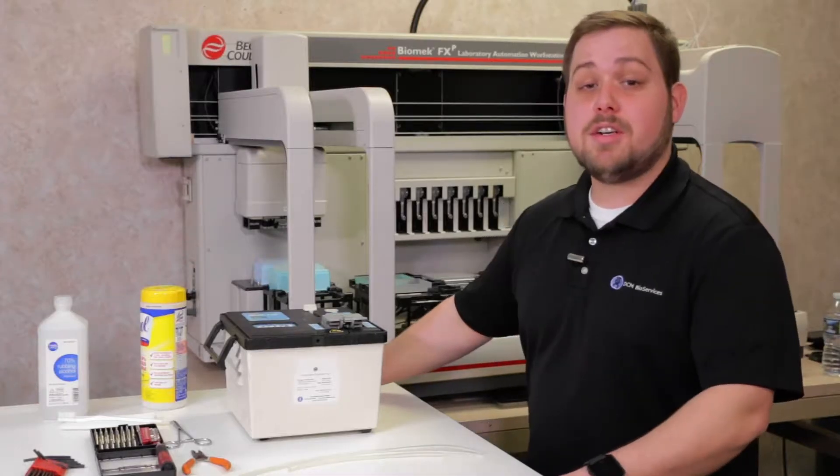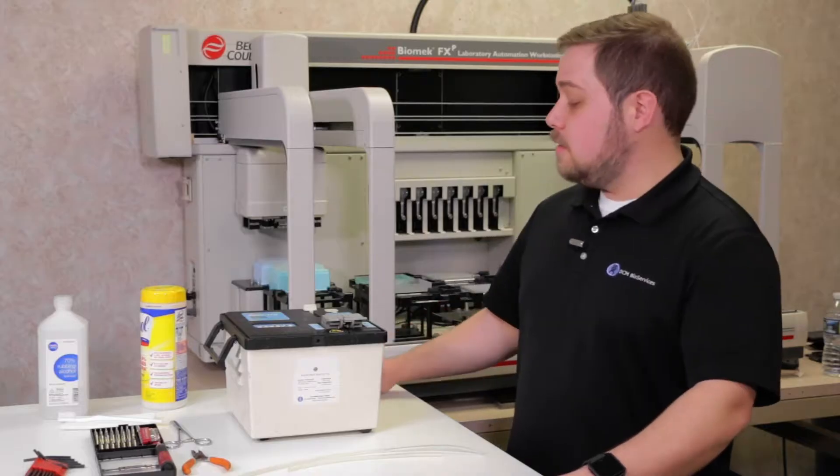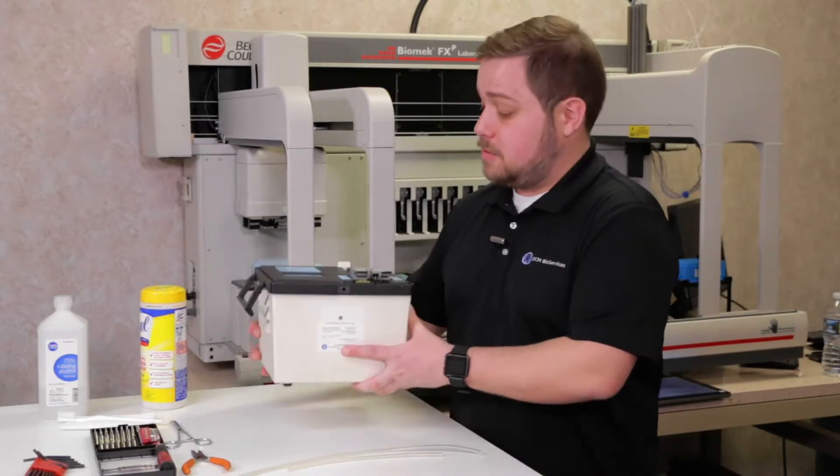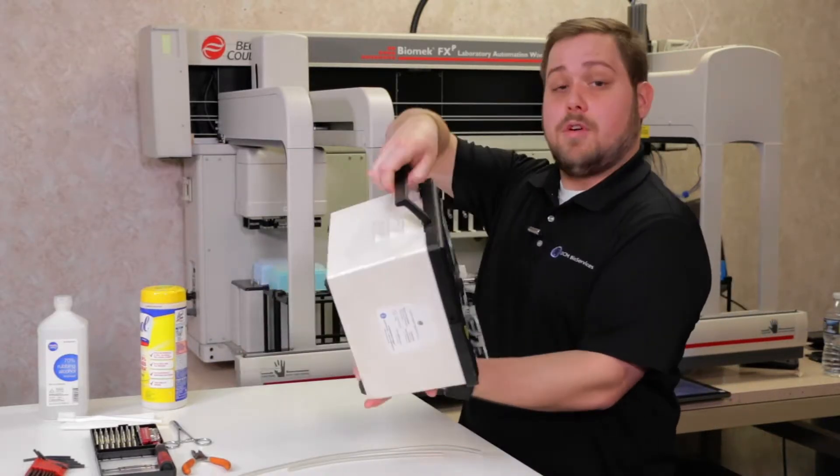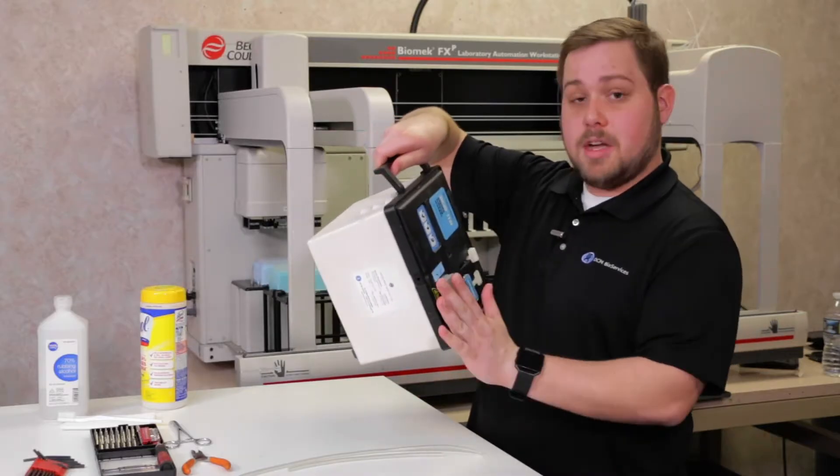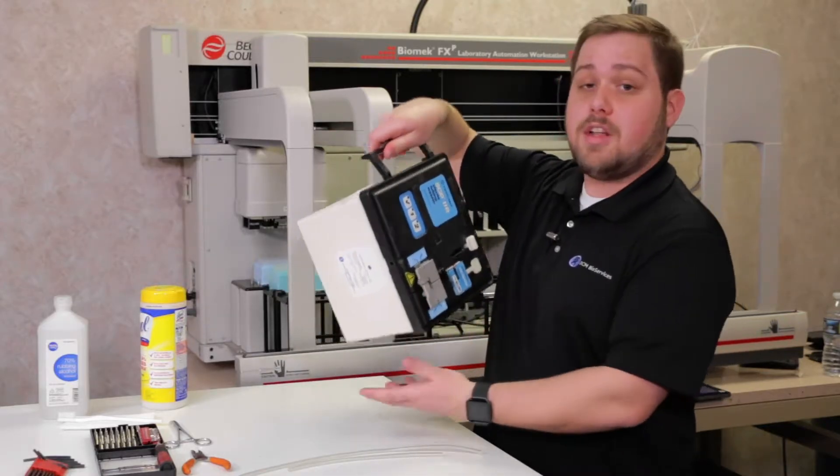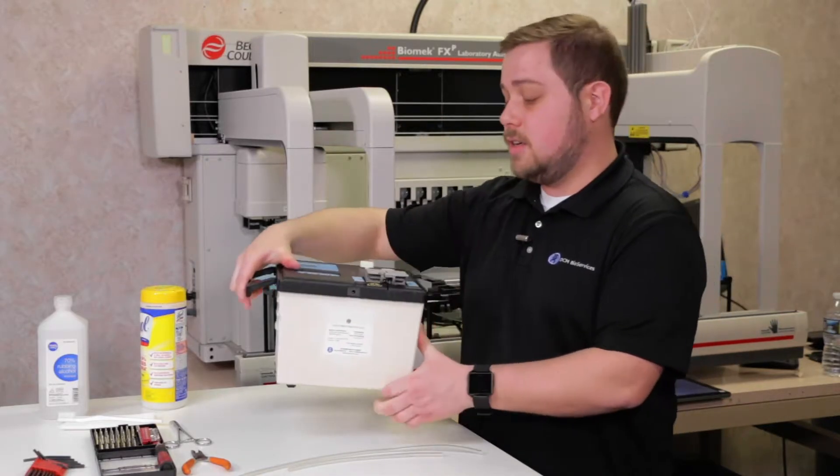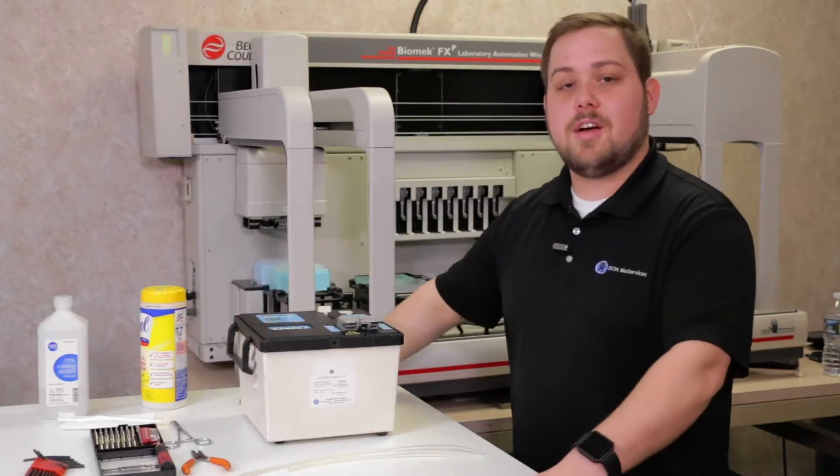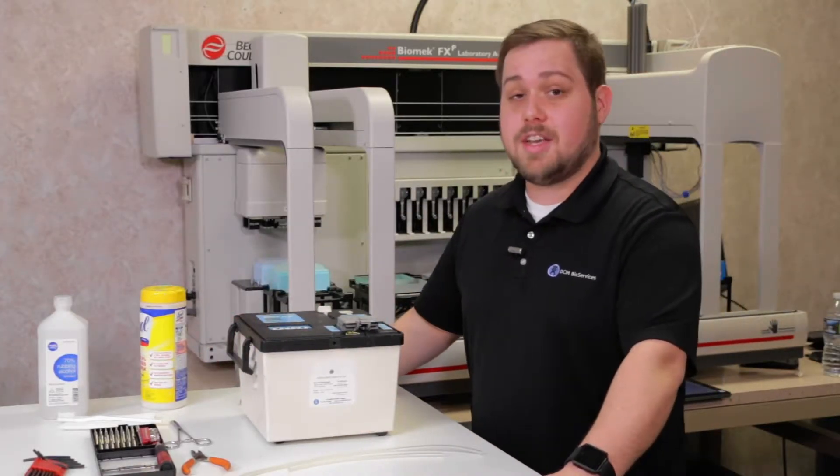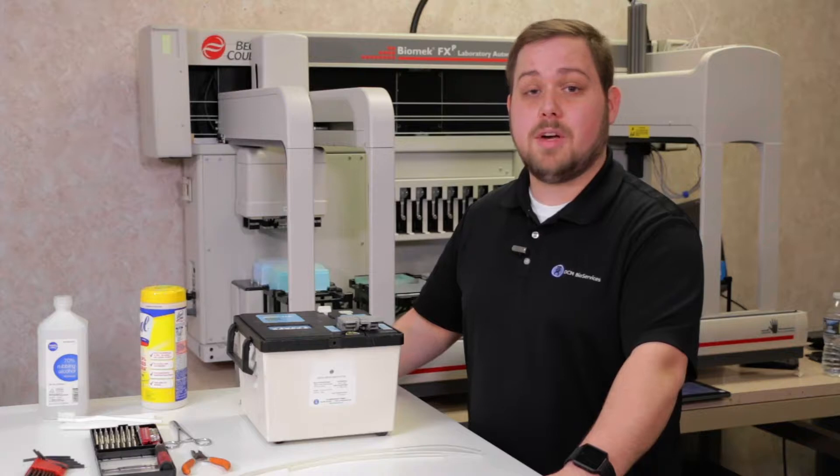When transporting your tube welder to storage or another lab, first unplug it and make sure to carry it either from the base or from the carry handle. Make sure that the tube carriers do not contact anything else, as you can knock the alignment out. Never store it on its side, upside down, or stacked, as this will cause misalignment problems with your welder.